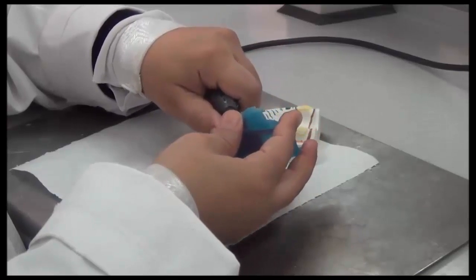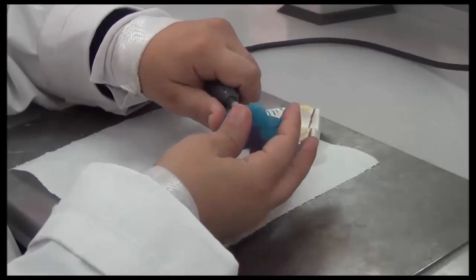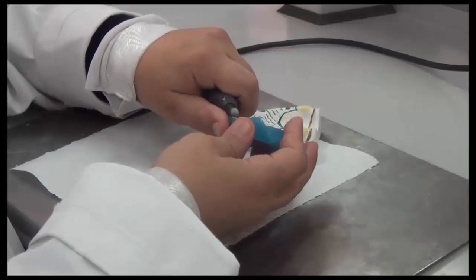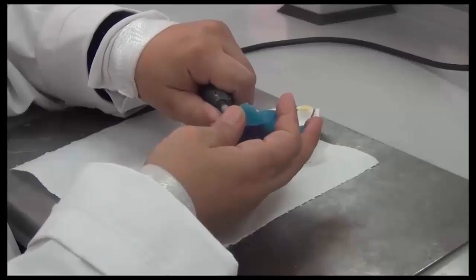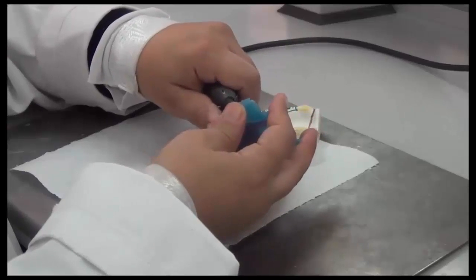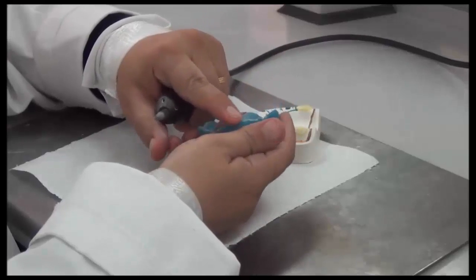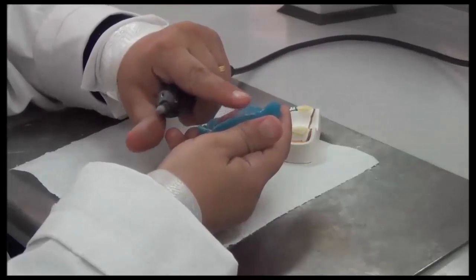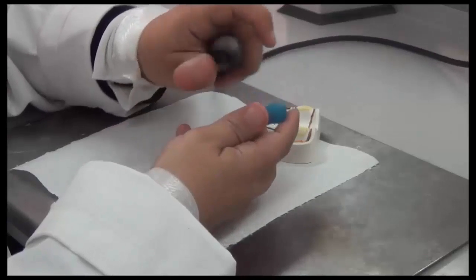In our case, because we placed Vaseline on the surface, we don't need a lot of trimming on the surface, or any trimming. On the borders, if they are rough and kept rough, not sharp, but a bit rough, this will aid in the retention of the green stick later on. So I will leave these rough borders present, but they are not sharp. They don't injure the patient. They're only just rough enough to hold the green stick into place.